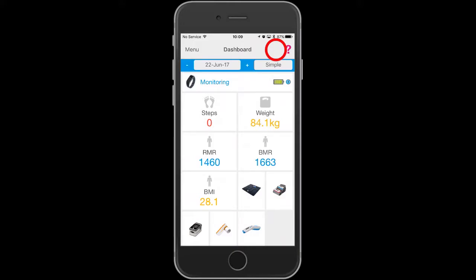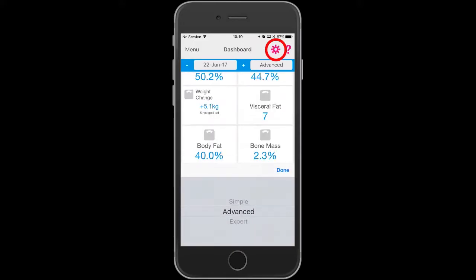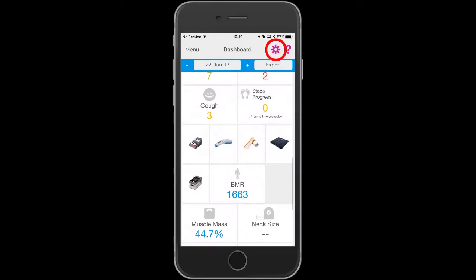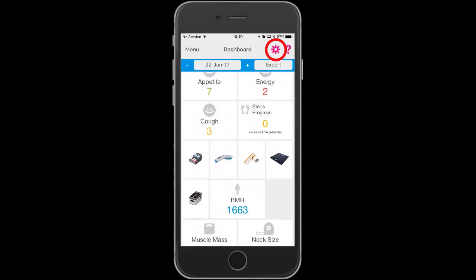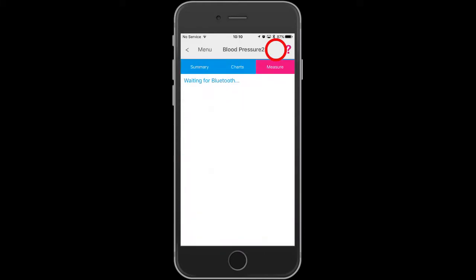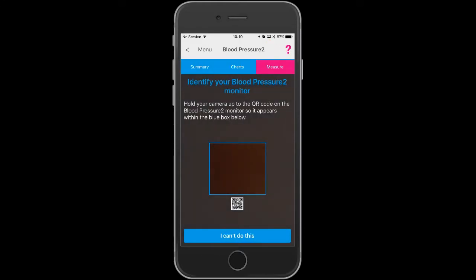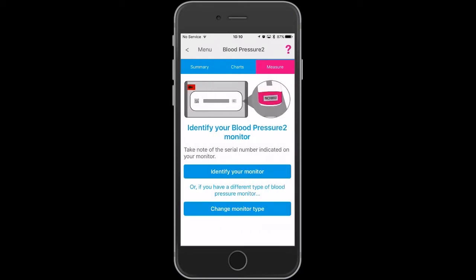In future, you can just touch the quick measure for blood pressure on your dashboard and it will take you to the instructions for taking a reading.